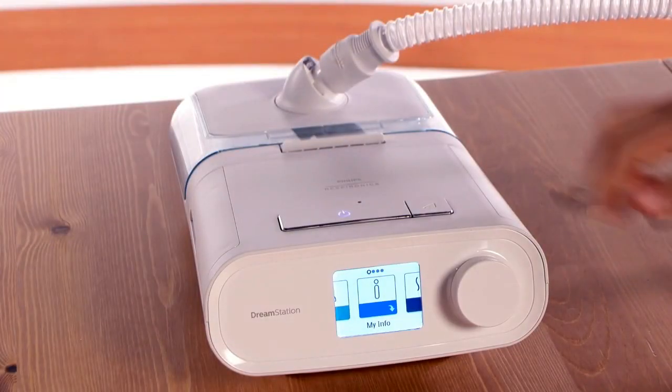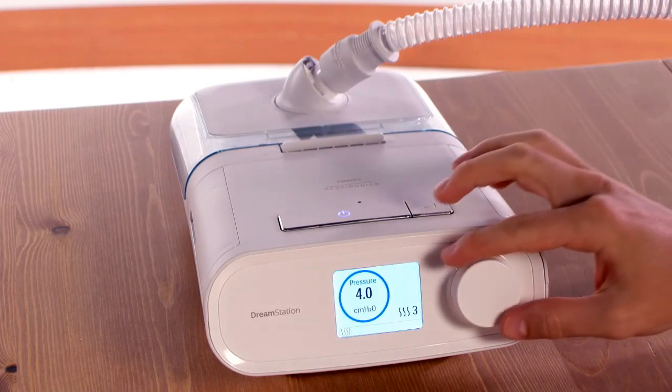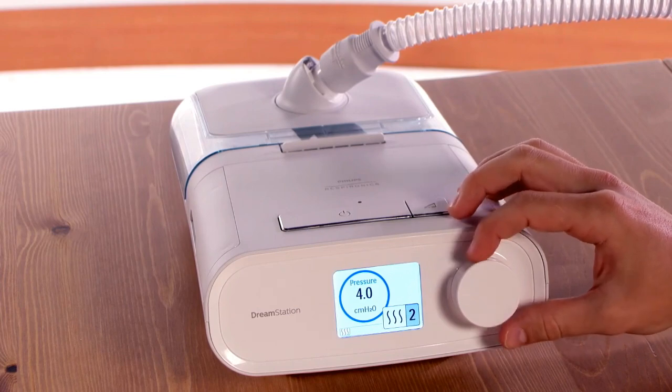When you press the therapy button, the humidifier starts up as well. You can adjust the amount of humidification by rotating the dial to the humidifier icon and pressing to select it.